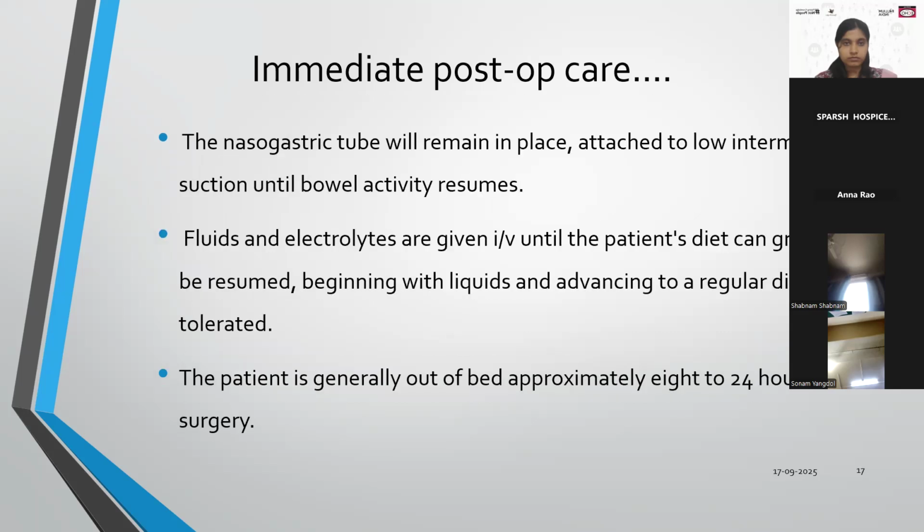Furthermore, the patient is instructed how to support the operative site when we make them take deep breaths, when we make them cough, do exercises. At that time they have to support the incision area and the bag also.